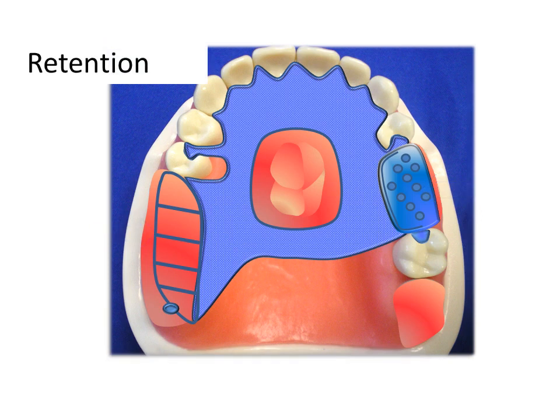Okay, Dr. Goon, how will we retain this partial denture, in terms of the direct retainers? The frenal attachments preclude the use of bar-type clasps. Although surgery is a possibility, we determined that aesthetics was not an overriding factor. On tooth number 4 we have placed a mesial rest and assumed a 0.01 inch undercut is present on the mesial. I would suggest using the cast round circumferential clasp. The round clasp configuration has improved flexural characteristics over the half-round clasp.